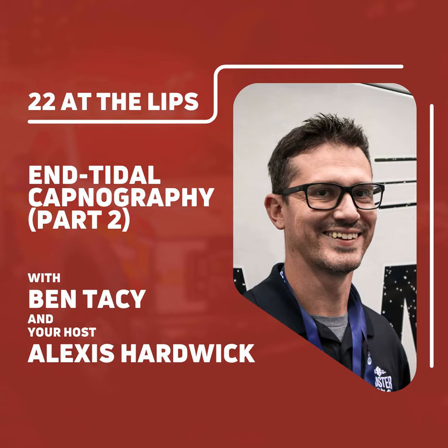Okay, so the way those work is it's taking a reading out through one side of the nose and blowing oxygen in through the other. So as oxygen's blowing through, it's going to start trying to pull some of the oxygen back through, and it's going to make it look like they're hypocapnic possibly. So again, we use that for trending.